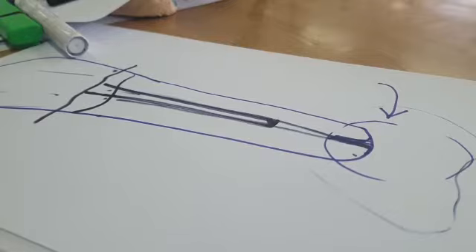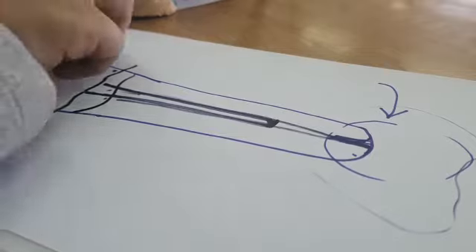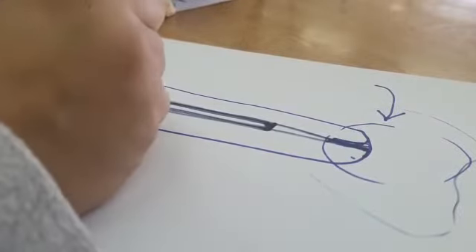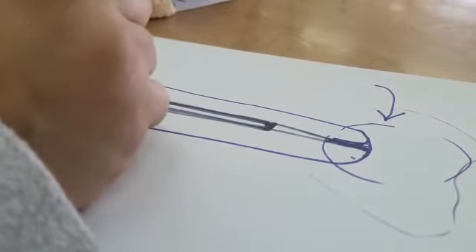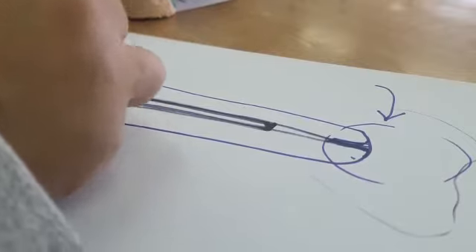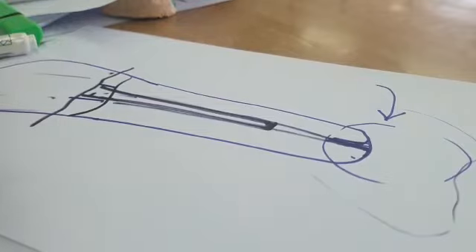The only option is to see a drill. Only drilling. What do you have as an option? Maybe with ultrasonic. I tried to do ultrasonic around it. I make like a trench, yes. I make like an extra space around it. Okay, very small space. And that to try to find a grip on it and ultrasound around it and try to find a grip and take it out. Okay? Didn't work.